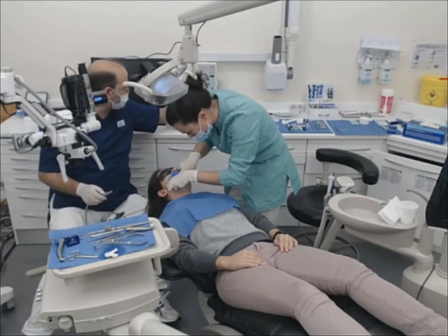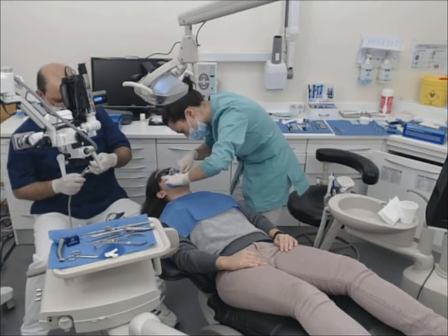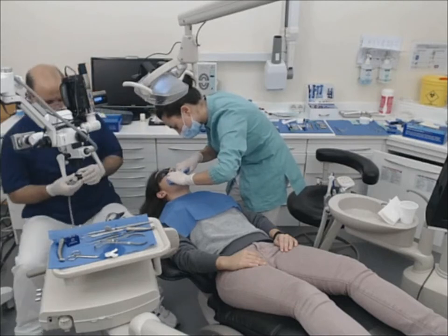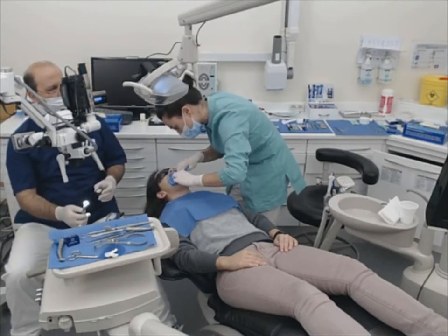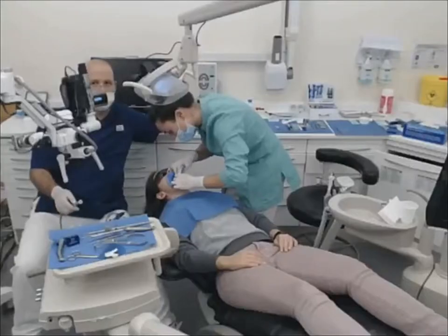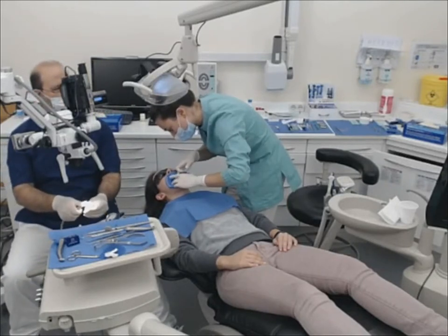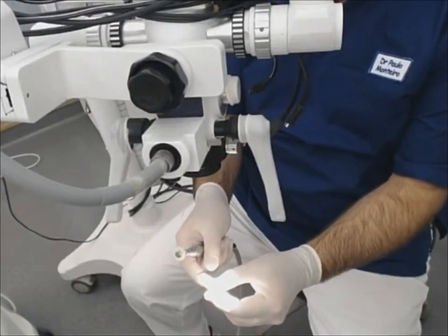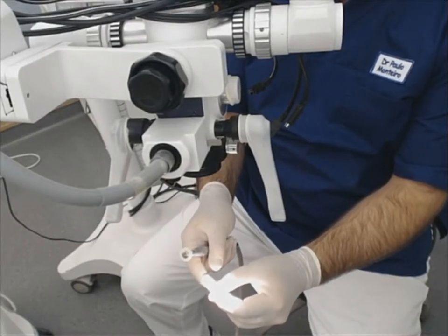I'm gonna start with the pink one, just to prepare the wheel. Okay. So this is the wheel, and then I'm gonna just take a little bit of the pink paste. And then I'm gonna pass on the surface. And when you pass the surface, look, we almost immediately start to have some shine. This is the first one. You see, we have it almost immediately.